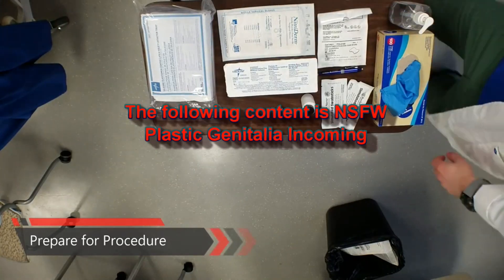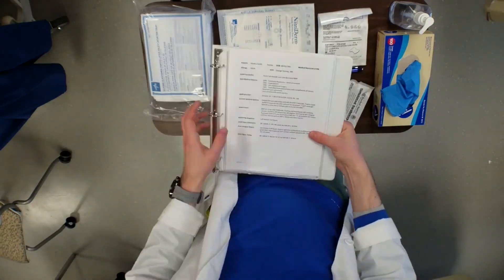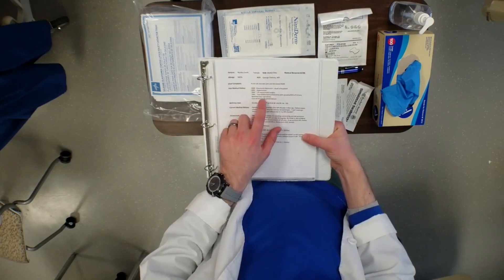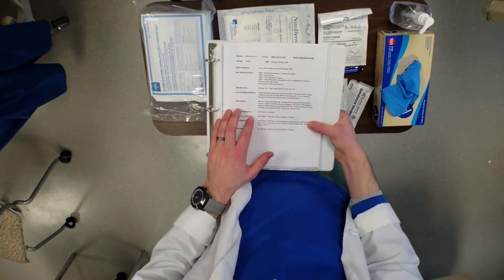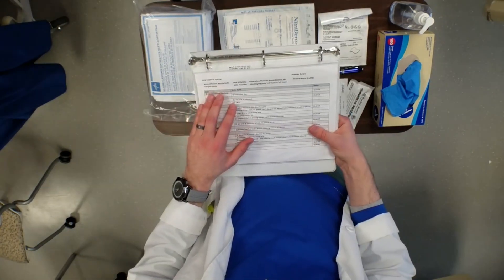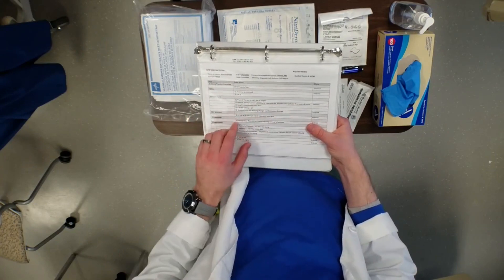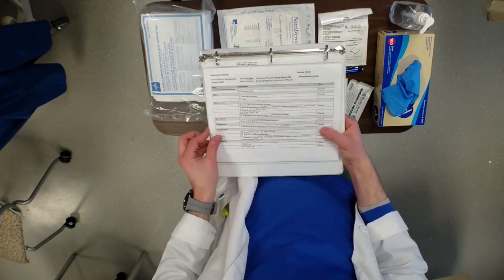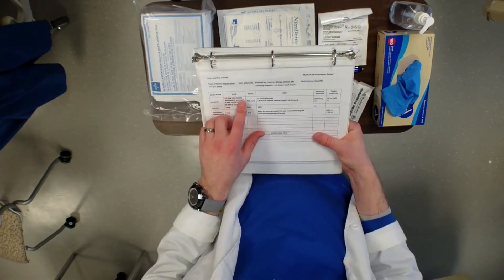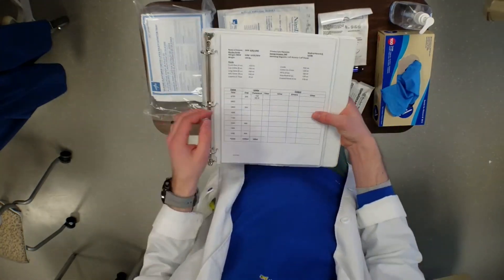After receiving a report from your evaluator, determine the urgency of the situation. If appropriate, take some time to wash your hands and review the chart. Be sure to go over the chief complaint, history, allergies, recent vital signs, orders, medications, and labs.